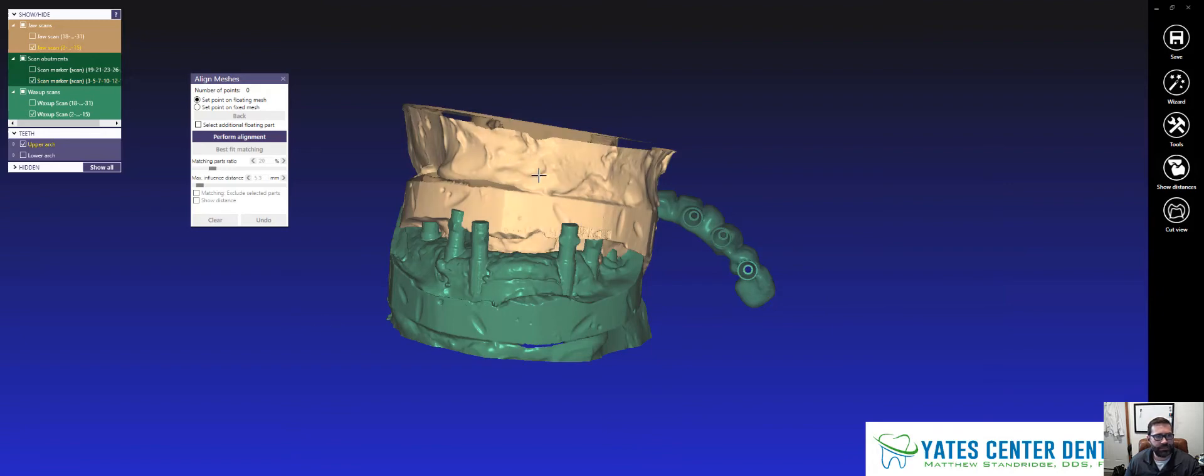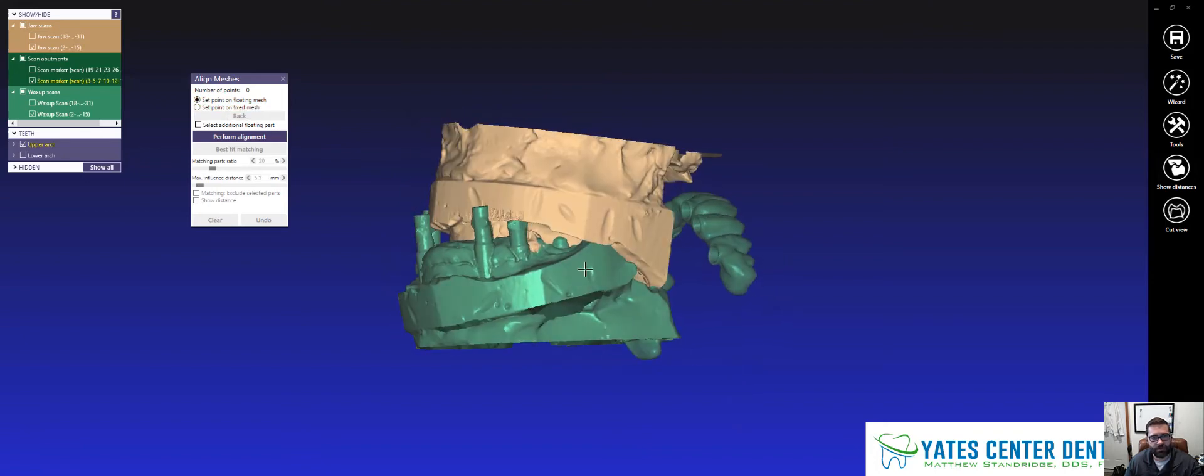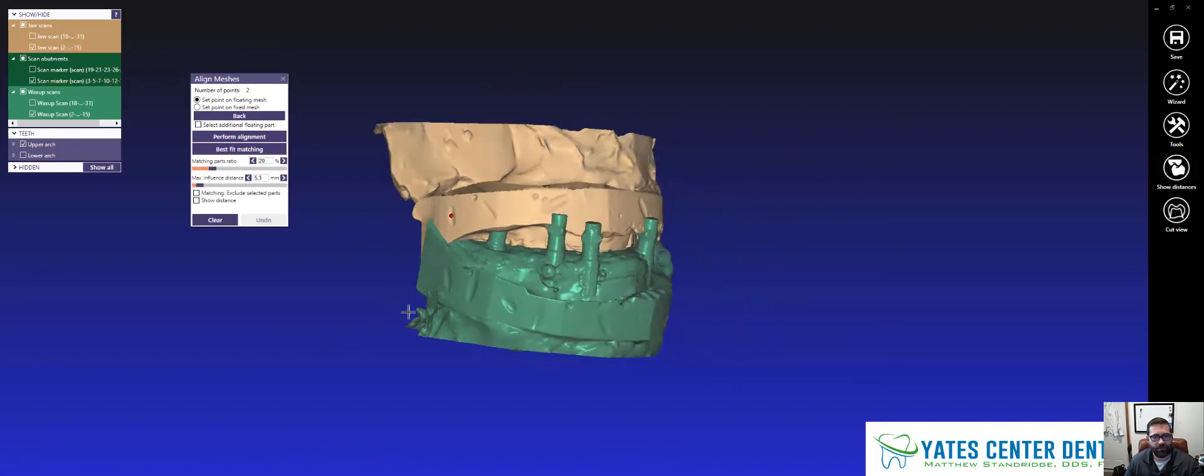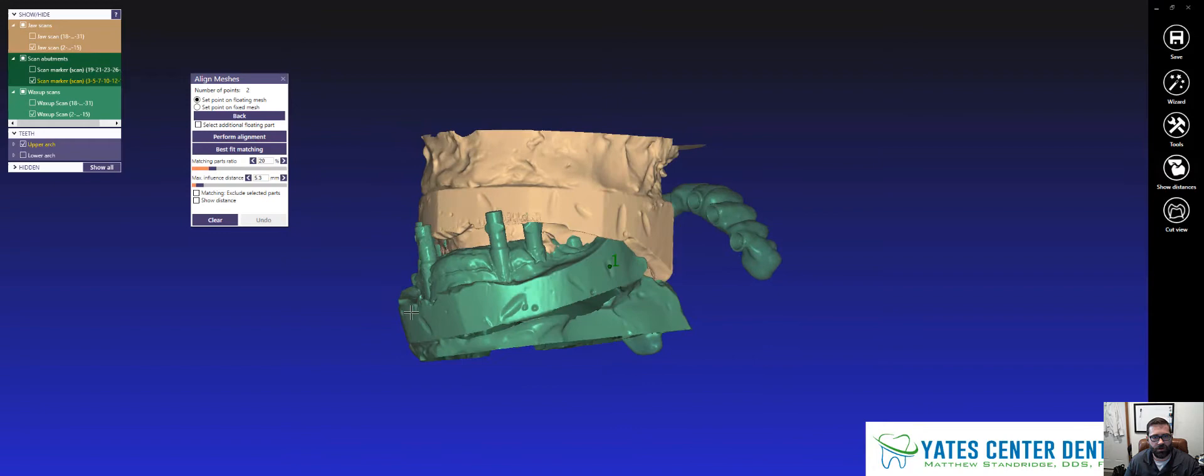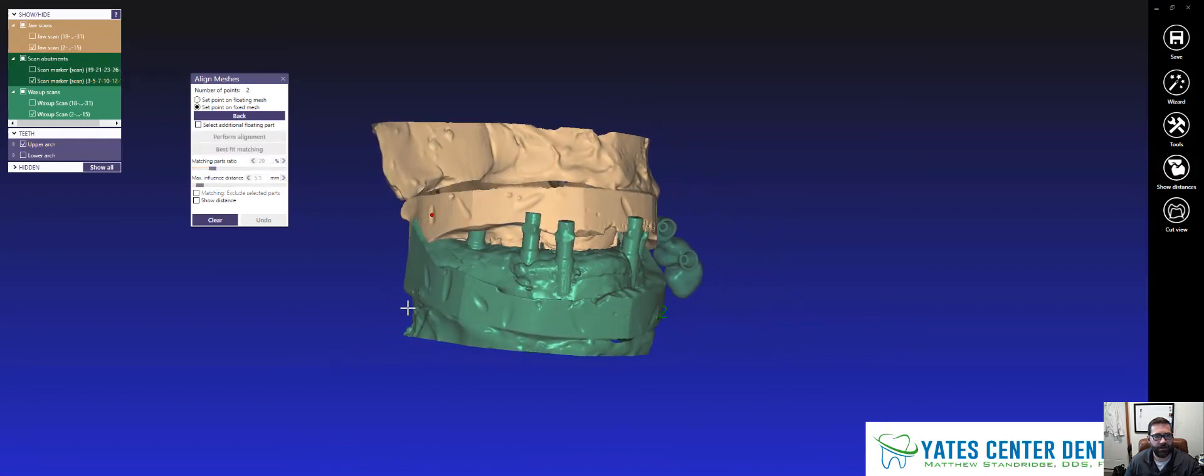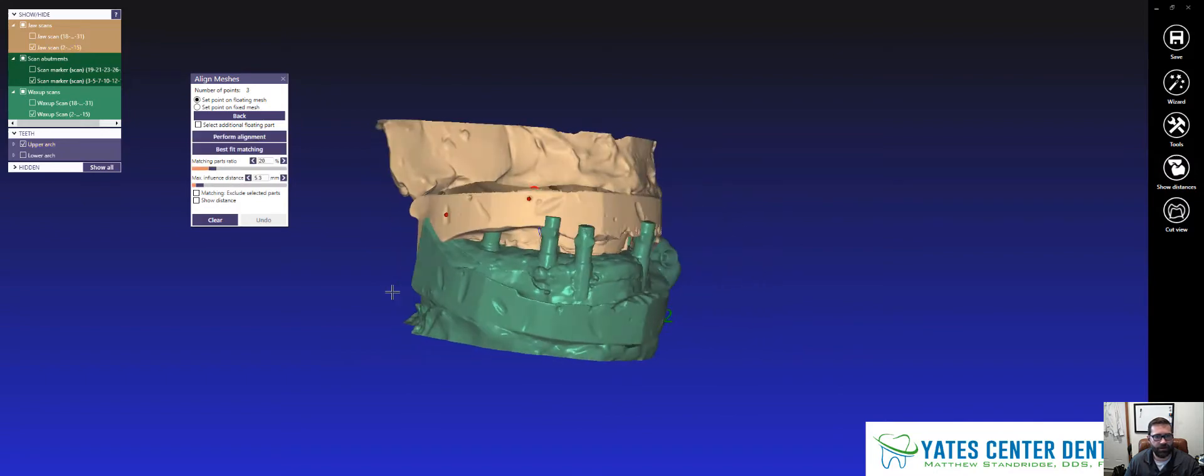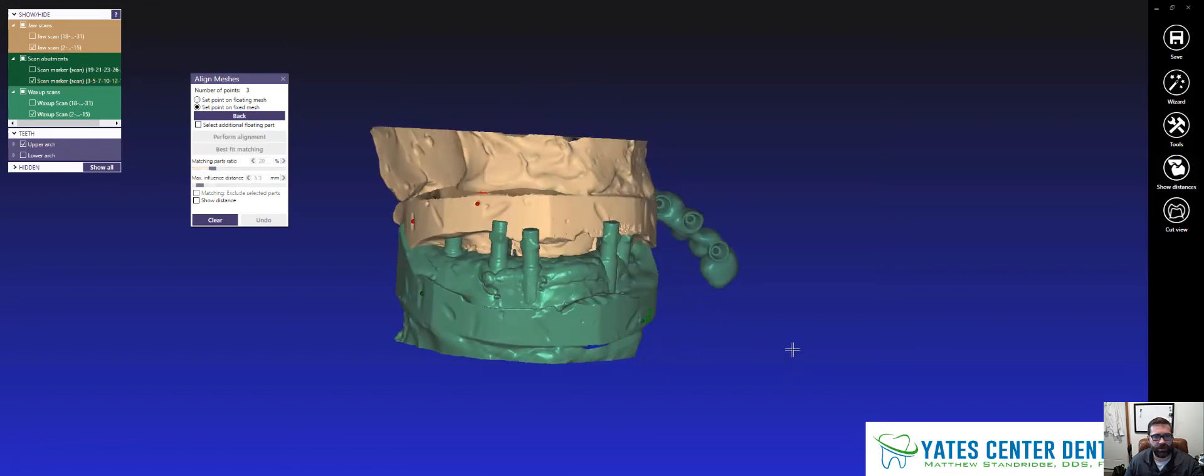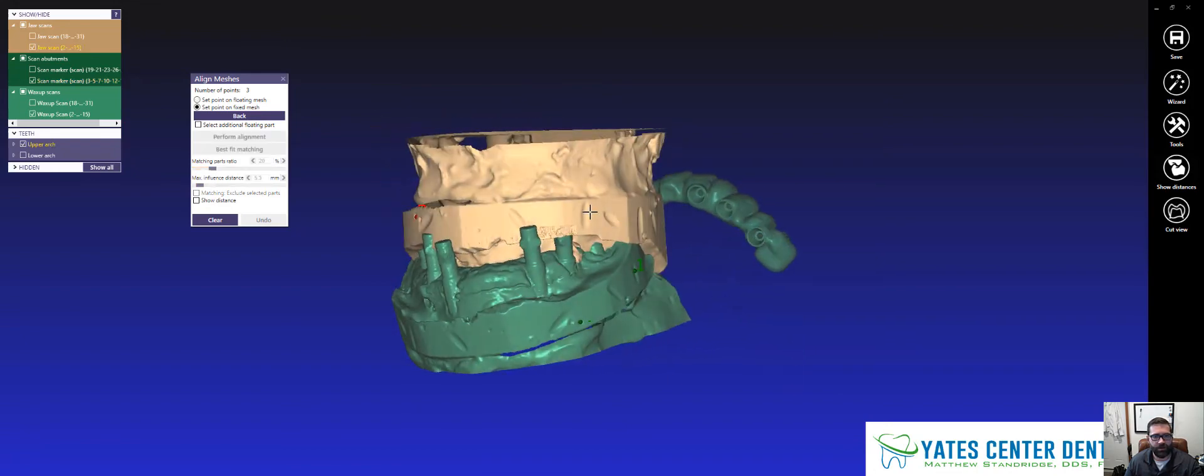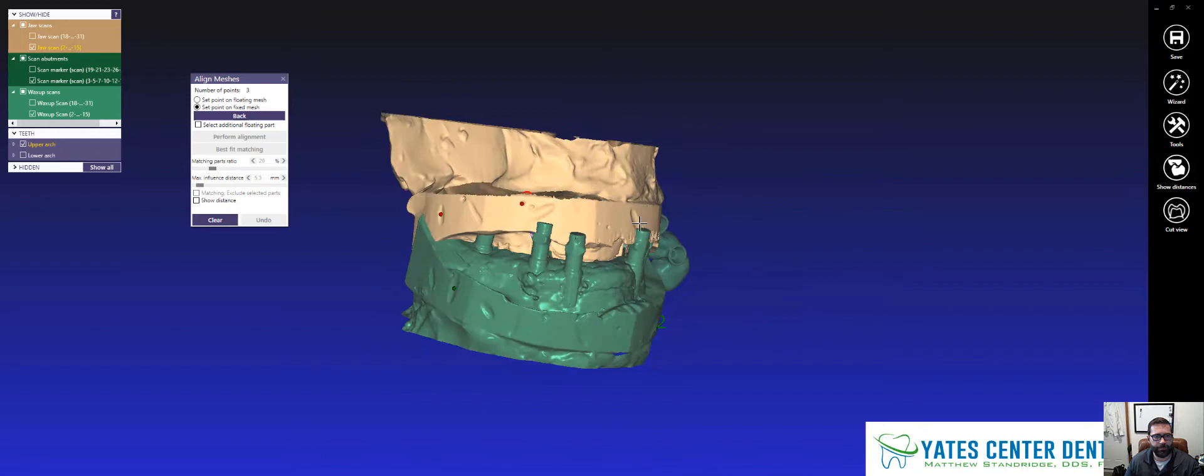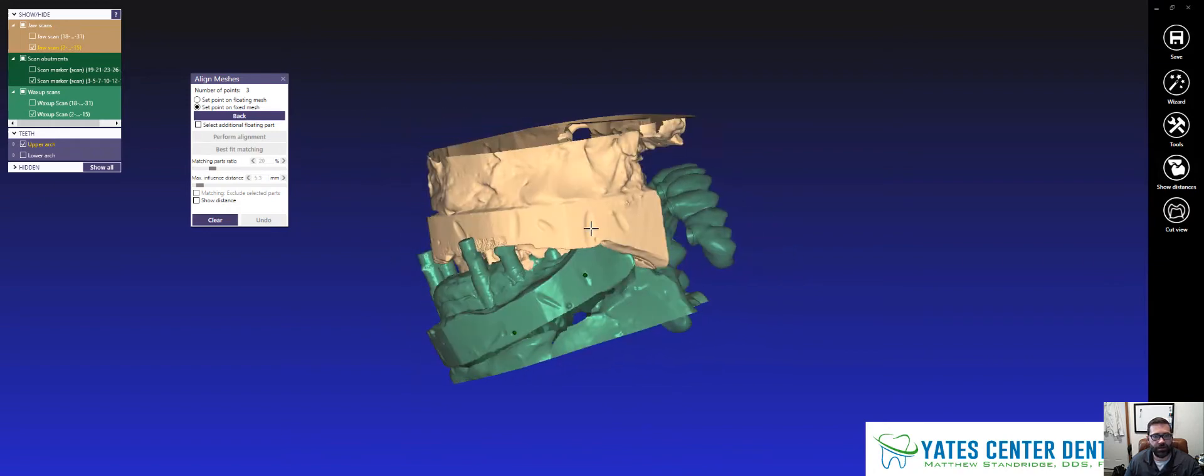And so this tan one is going to be my fixed mesh. So you're going to see I set a point on the floating mesh and the fixed mesh. And so I'm just going to pick three or four points for this all to relate to. That little divot right there goes with that little divot right there, so on and so forth. This guy right here is right over here. It's actually this guy right here.